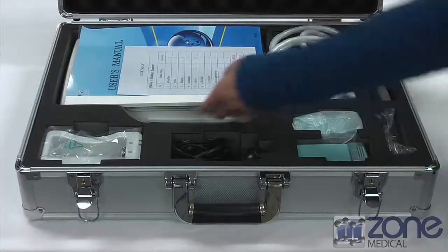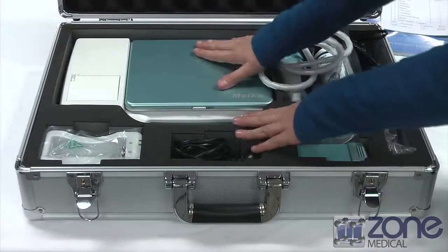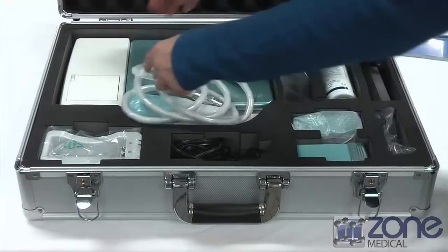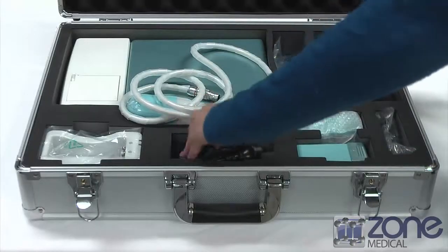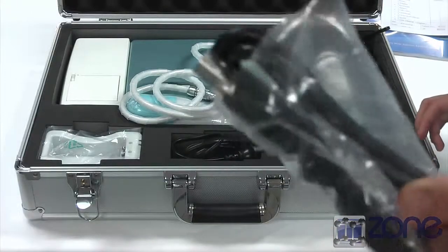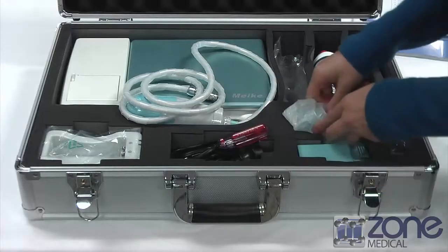Once you open the case you will find the user manual with a list of all the different components found in the case. Next you will find the device itself and the probe alongside it. It also comes with a bottle of ultrasonic gel, a charger, and a USB cable to connect to external drives such as a PC or a printer. There is also a screwdriver for the stand, and the last thing you will find is the actual battery and the battery charger compartment.